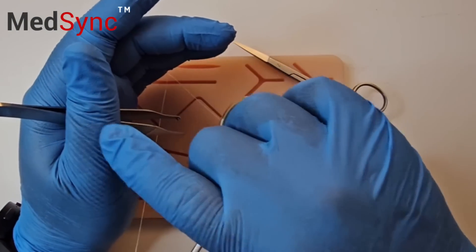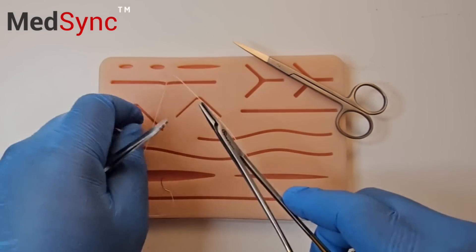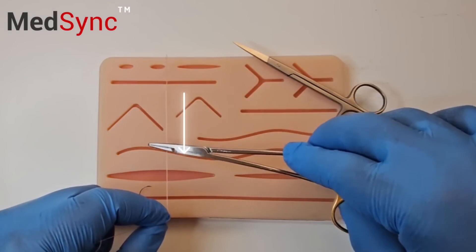You palm your forceps — do not put them down. Advance the suture with one hand. Create a short end and a long end.